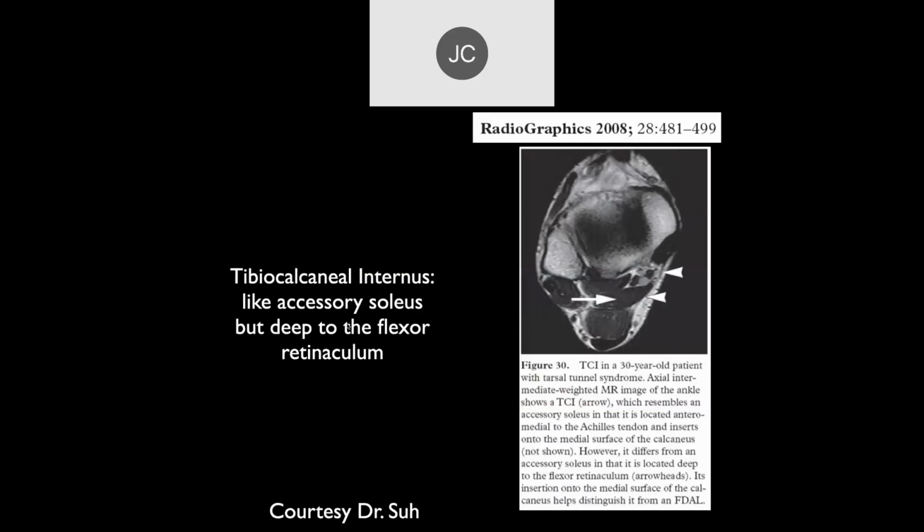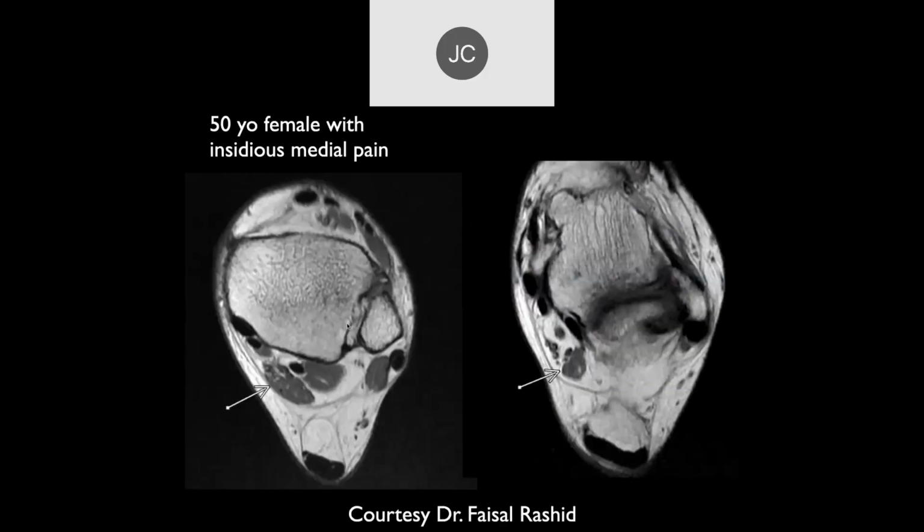Tibiocalcaneus internus. Alrighty, so it's fun and games.